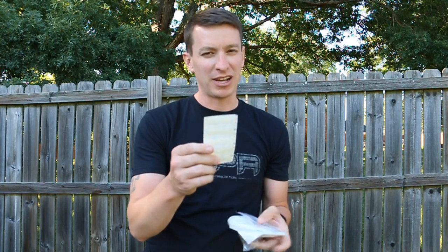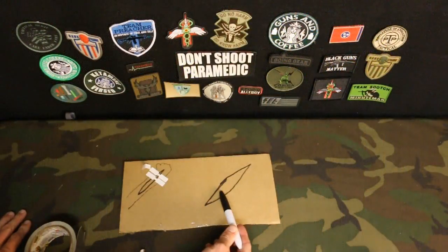So one of the things I like butterflies over sutures is the fact that if you suture something closed and you suture all the bad germs inside, really before you start to see it, you've already got the infection building up. And I've already done a video about sepsis, about how that would be a huge problem in a grid down situation. With using butterflies, then you can open it and close it twice a day, once a day, clean out the wound and reclose it back up. And that's going to help you prevent infection in the long run, I believe.